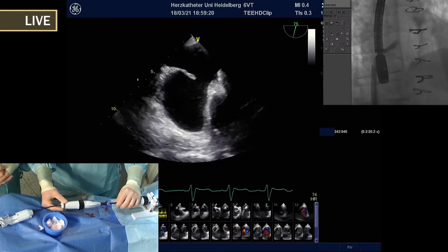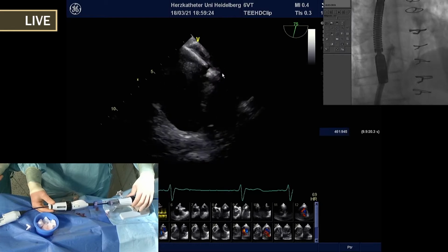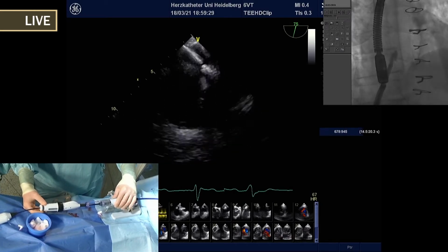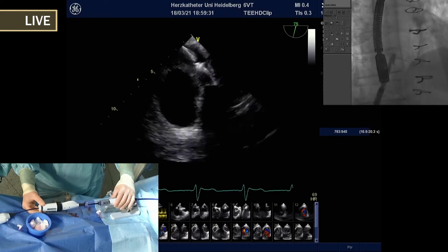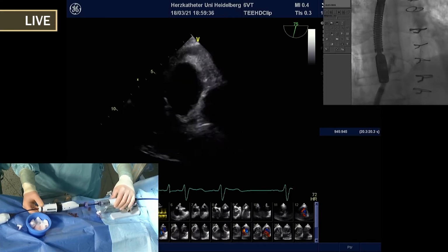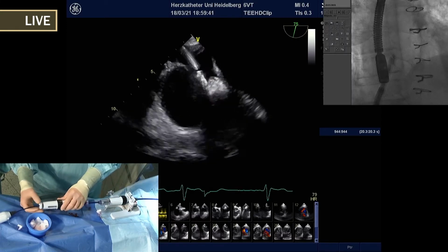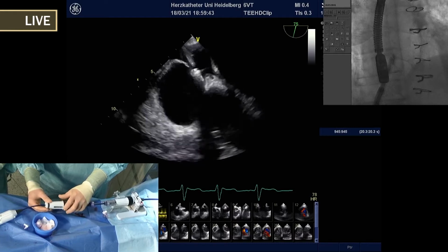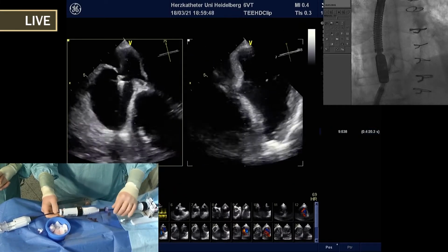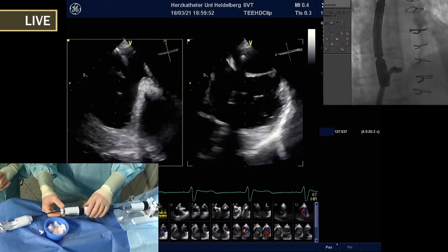So I typically like to take an inflow chamber view, which is, as you already do it, you see you're stretched a little bit and you go against, so to look at the aorta and then to flex down there. And this anterior part and also a little bit more lateral part is quite beneficial. Now you're down and now you can flex and advance. Now you're through. Yeah, and you simply advance. Very nice, now you're in the chamber. Looks good, perfect. Yeah, nicely done. Perfect tip.